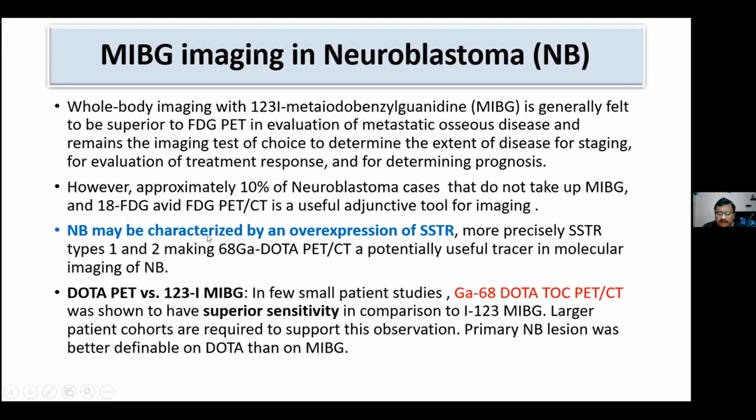Neuroblastomas may be characterized by an overexpression of somatostatin receptors, more precisely SSTR type 1 and 2, making gallium-68 DOTA a potentially useful tracer in molecular imaging of neuroblastomas. This is also nowadays being done.